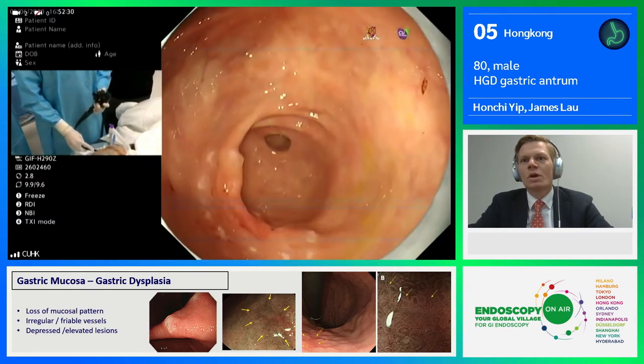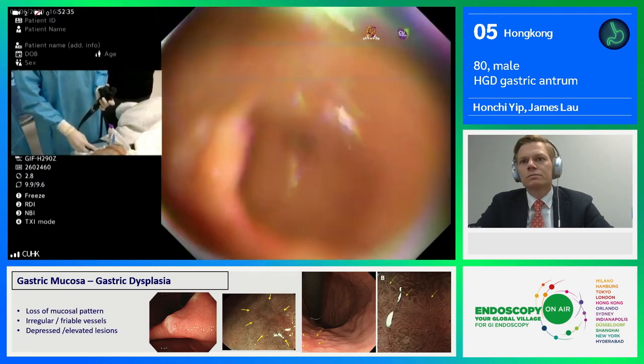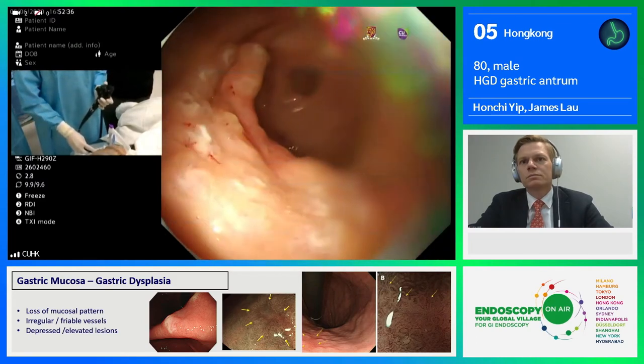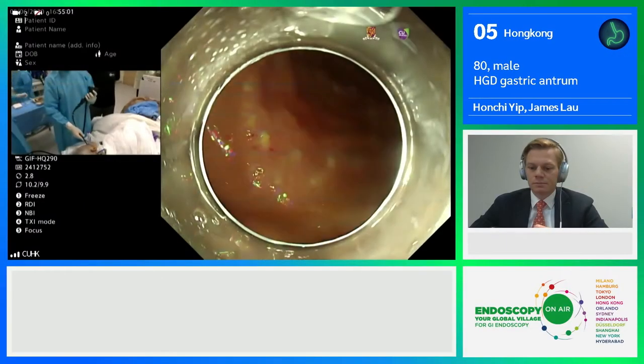In this lesion, I think this is rather a fold, but not a muscle ridge. So overall, it's still potentially endoscopic resectable.